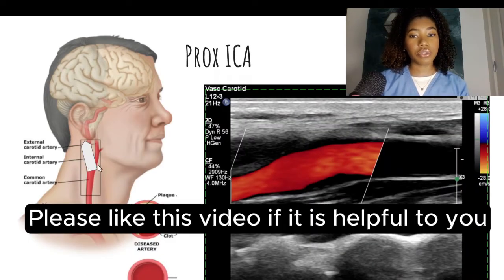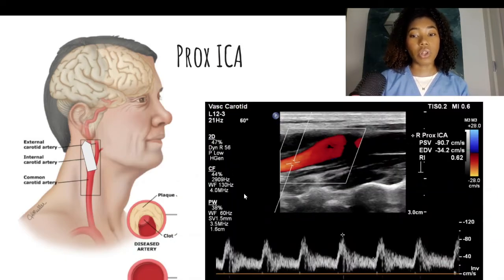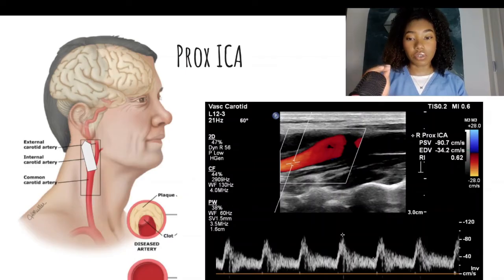Next, we're going to image in color Doppler and then pulse wave. Your sample gate should not be too close to the bulb because that's where you're going to get a lot of flow reversal. You want all of your flow, if this is a normal carotid, to be above the baseline — not below. You want a clean spectral window if you can. One way to differentiate the internal carotid from the external carotid is the internal carotid waveform will sound like a washing machine.